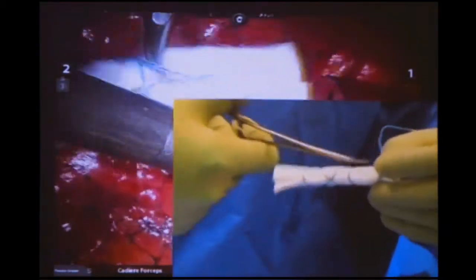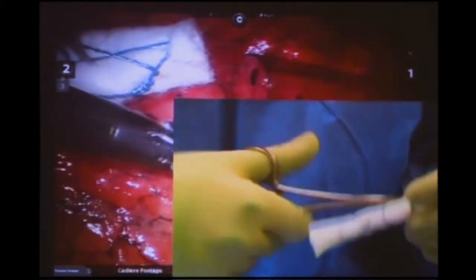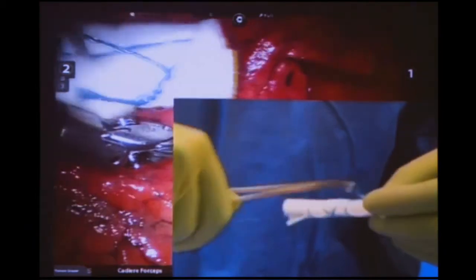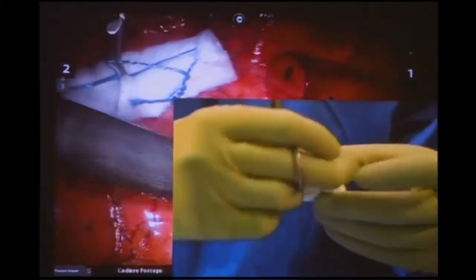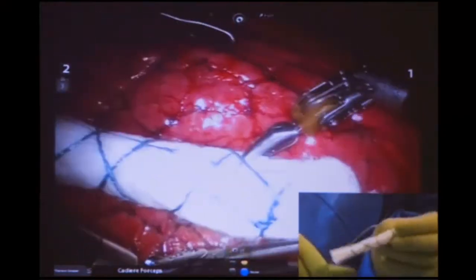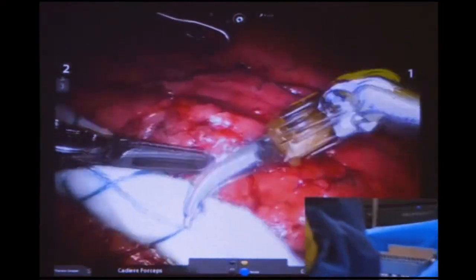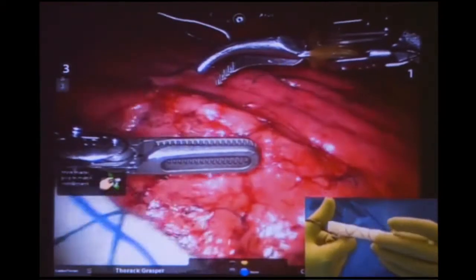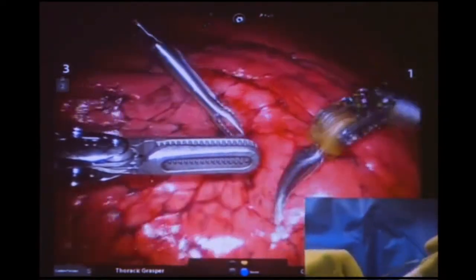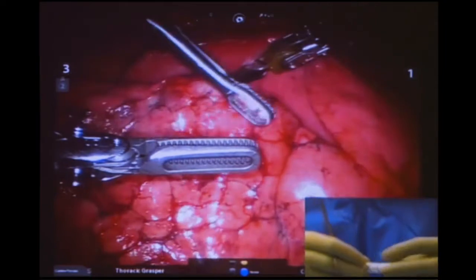One thing to notice: I've got my assistant port just here so I can keep an eye on my assistant. I have quite junior assistants, and I really don't like them poking around unseen — when I had their port right down there, they kept hitting the diaphragm and causing small bits of damage. So I do like keeping an eye on my assistant.